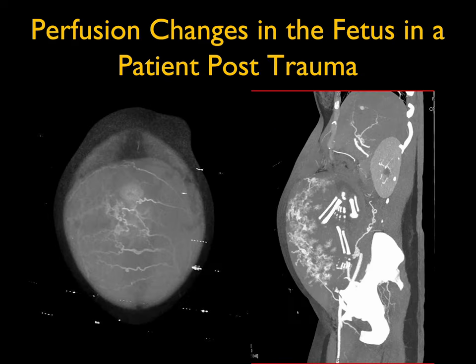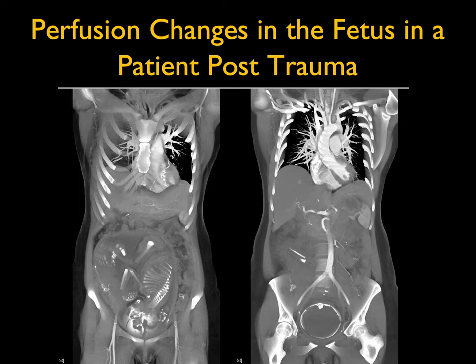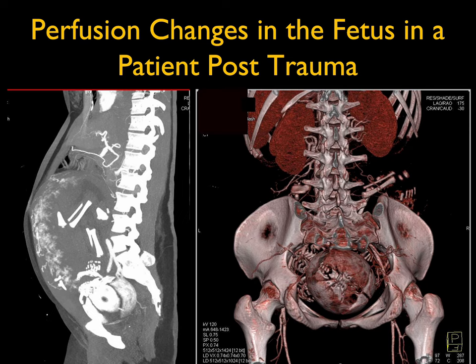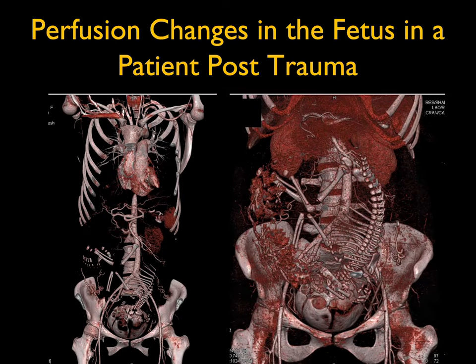Case four: a patient who is post-trauma and pregnant. You look for injury to the organs of the mother, but you also look at the placenta. If there's placental injury, you could see decreased enhancement of the placenta, and that may push you to deliver the baby, particularly if the child is over 30 weeks. Here you see the placenta and the fetus in good position. The patient is old enough to be delivered, and I am concerned about the placenta because there's not enough enhancement.